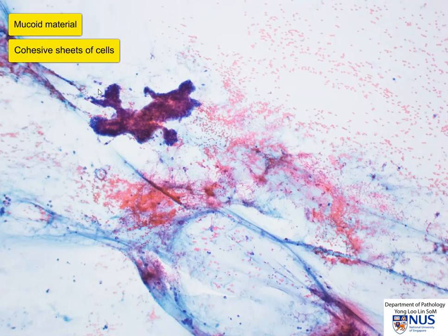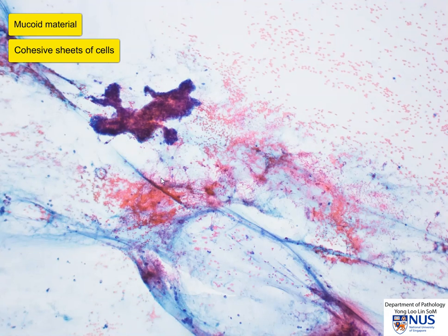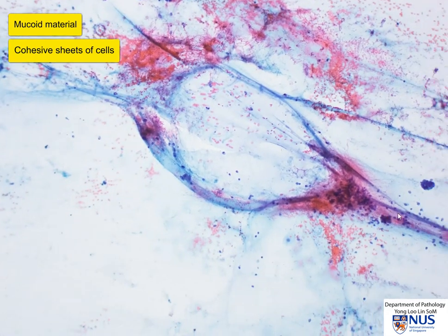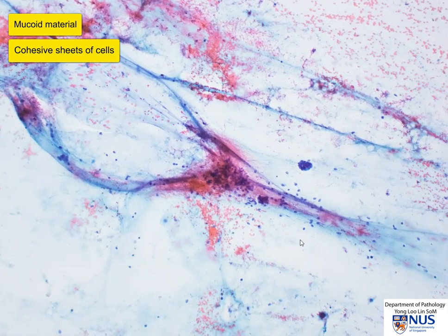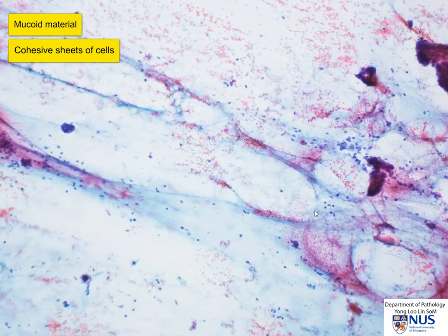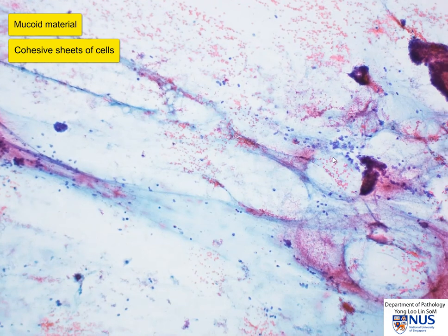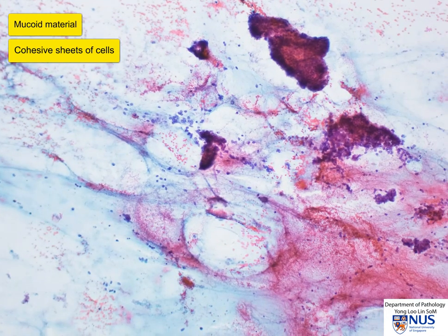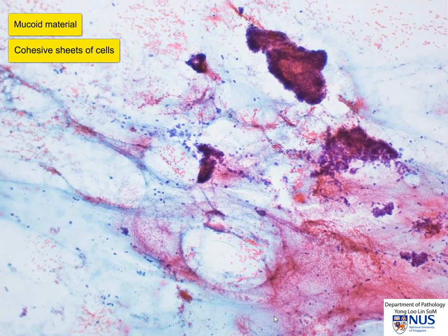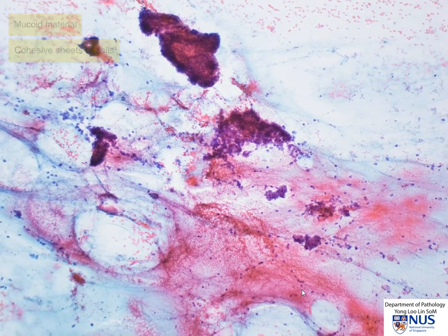Coming on to slightly higher magnification, we can see some branching and cohesive sheets of glandular cells, and at the same time some streaks of mucin in the background. There are also occasional single nuclei, and this area is a little bit more cellular.